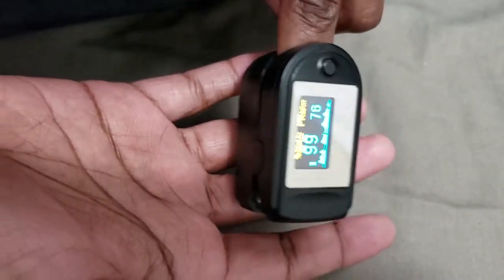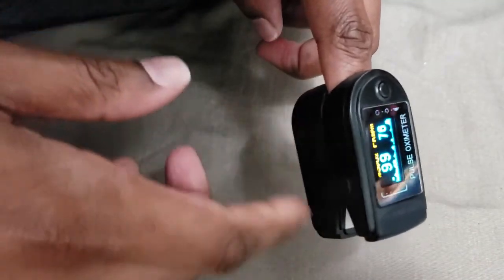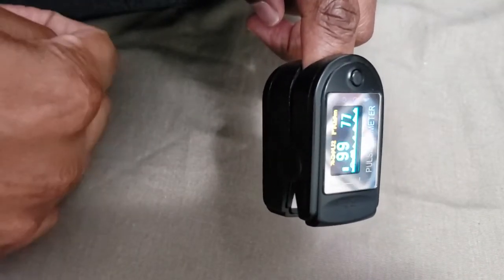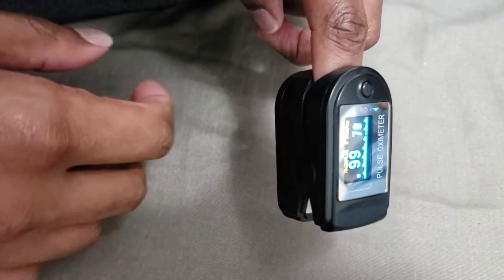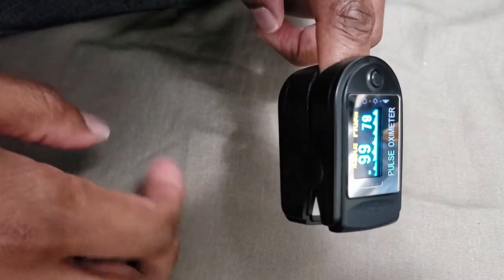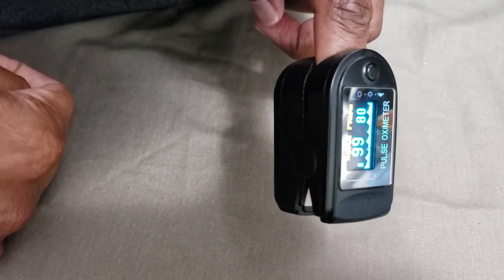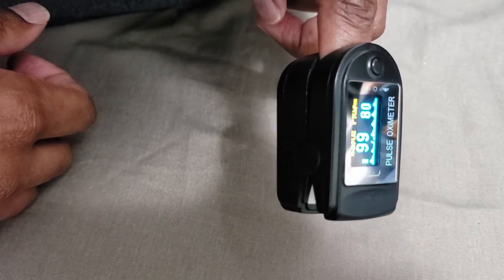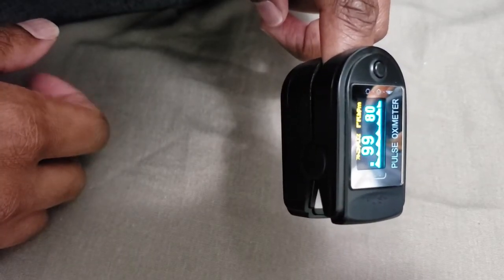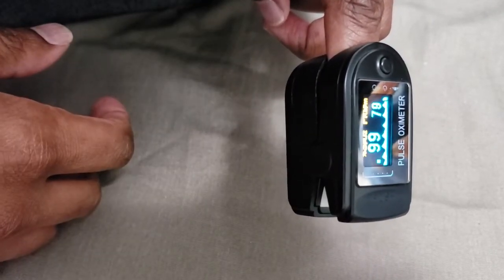Now, should you use one of these on your cell phone? This is a dedicated machine. I'm really not sure how accurate the ones on the cell phone are. So I would honestly buy one of these versus using the one on the cell phone. Someone's made an app to turn your flashlight into a pulse oximeter. So I would see if you can buy a dedicated one. But maybe check out the app and see.